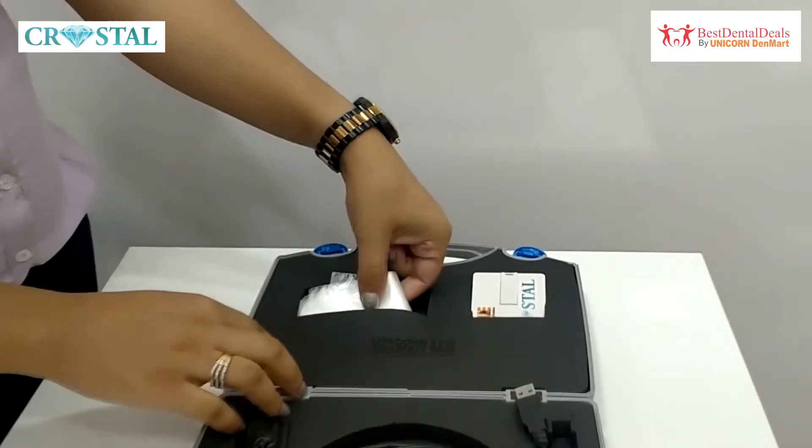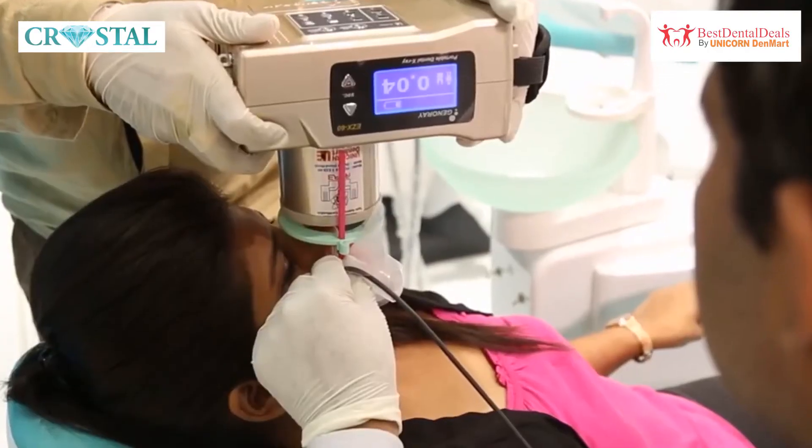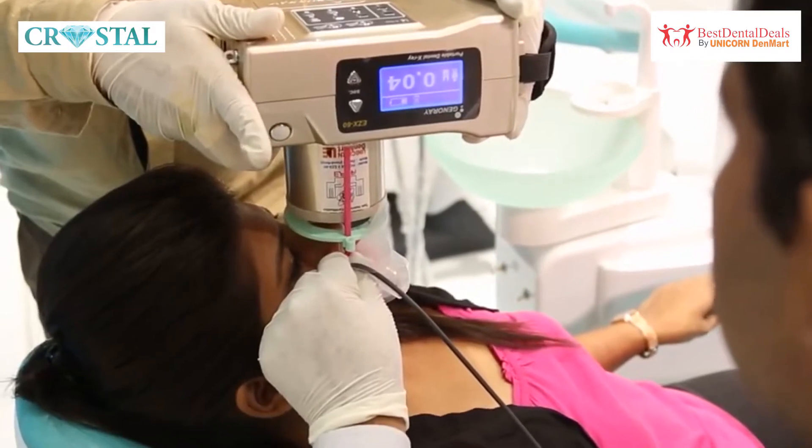It comes with a total of 500 disposable sleeves to cover the RVG when inserting it in the mouth, to prevent cross-contamination.